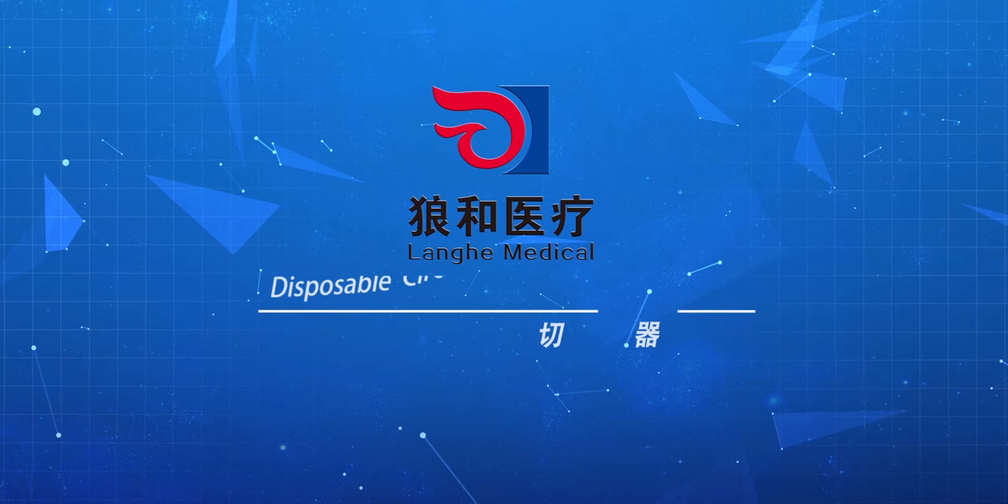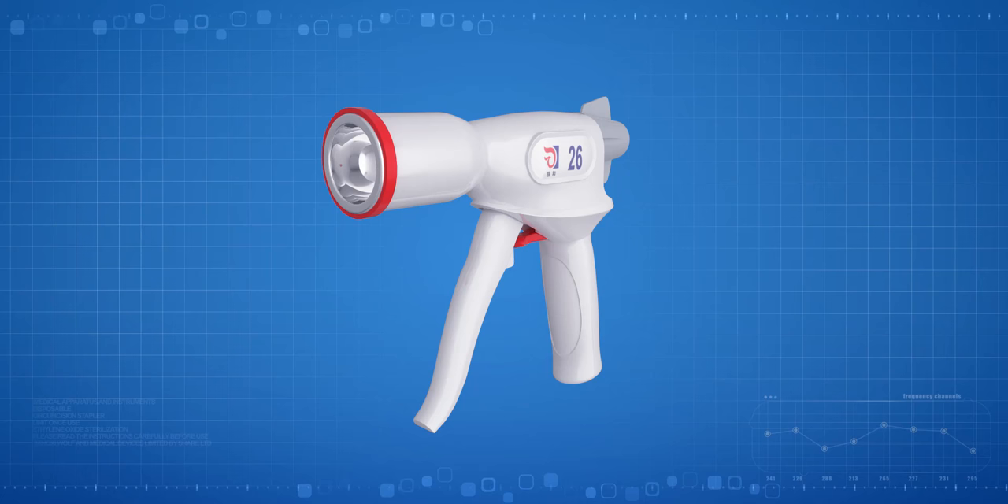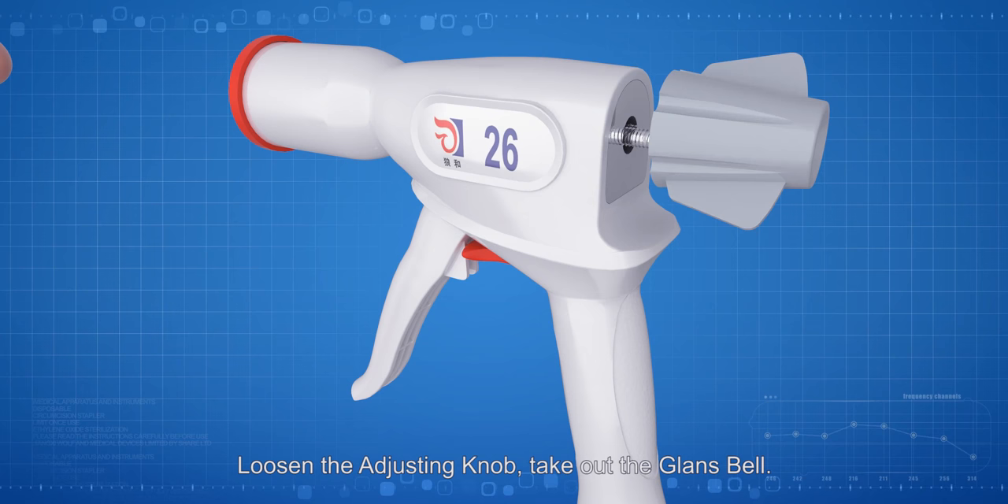Operation demo for the Langhe Disposable Circumcision Suture Device. Loosen the adjusting knob, take out the glans bell, and take out the staple cabin cap.